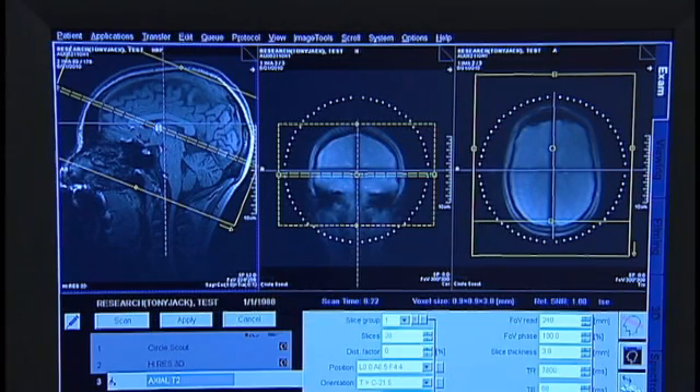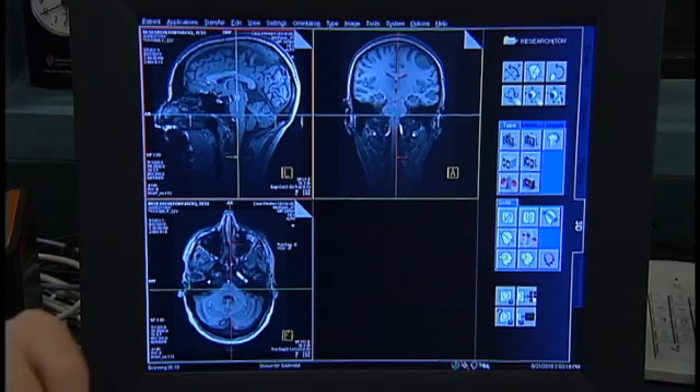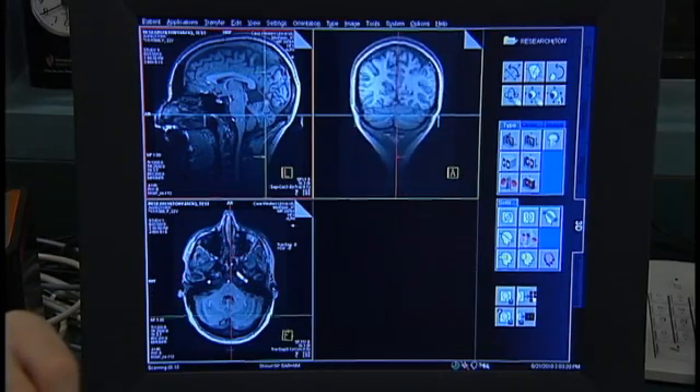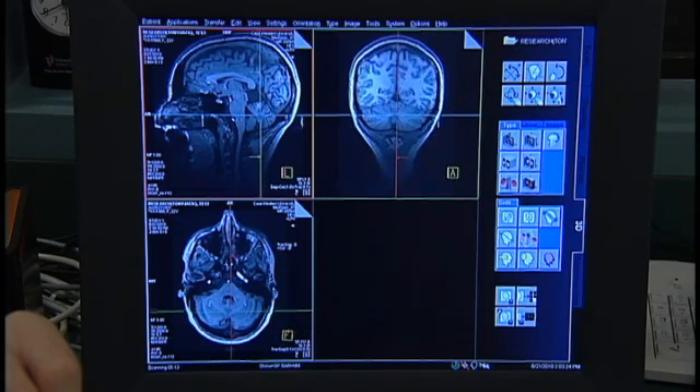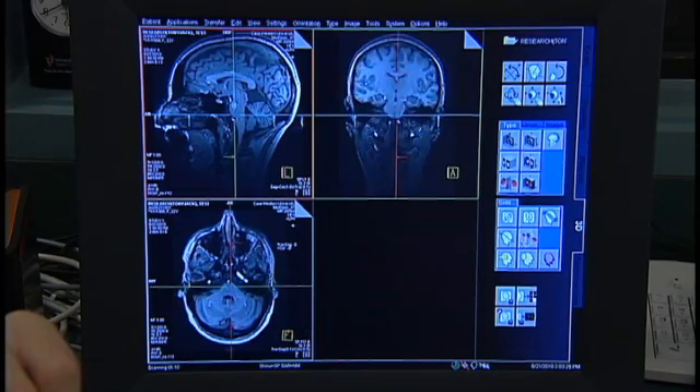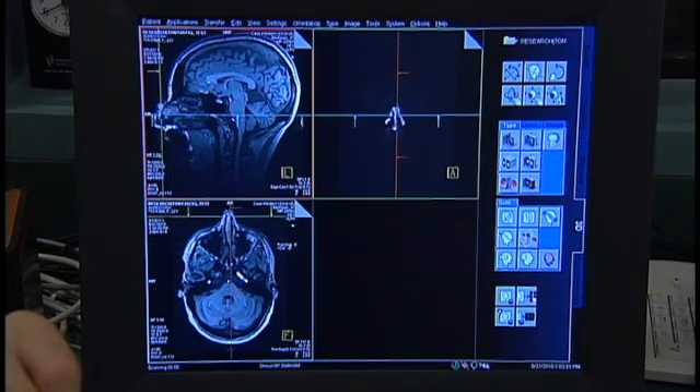Next, a high-resolution anatomical image called MPRAGE, or T1 weighted scan, is collected. The MPRAGE takes just over nine minutes. During this time, the participant practices the task. This scan provides structural information which can be used to assess individual differences in gray and white matter. The localizer scan is used to help position the field of view for this and subsequent scans, which is often referred to as slice positioning.